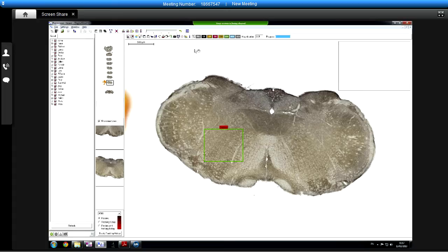And my other experience is that the further afield that's being analysed is from the real thing that you want to analyse, the more it just slows it down, as if it's going, oh, I don't know what to do here. So that's why I say, even if the tissue occupies a large amount of the slide, it's still generally better to mark reasonably precisely the actual tissue. Okay, so is this caption just a placeholder, or is this an actual representative area that you might count in? It could be, yeah, we call it GI. Okay, so you just see how.